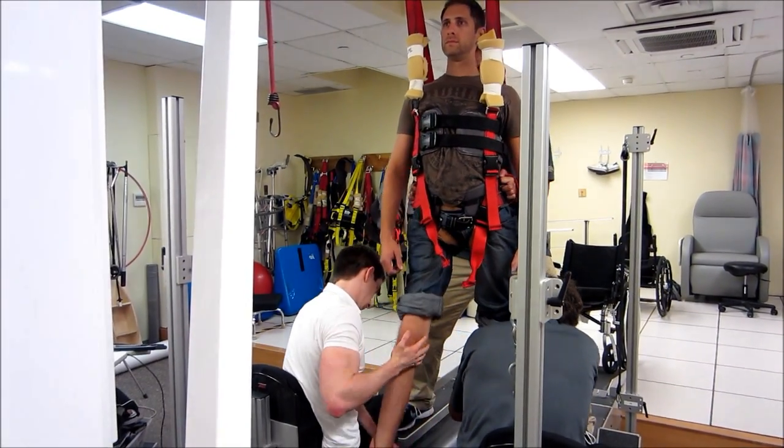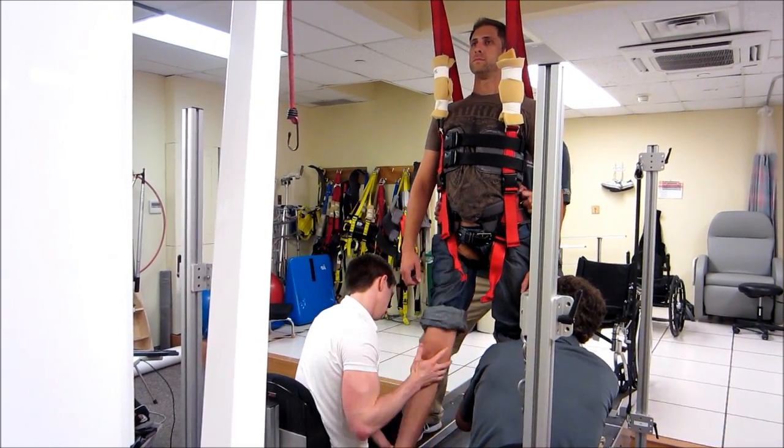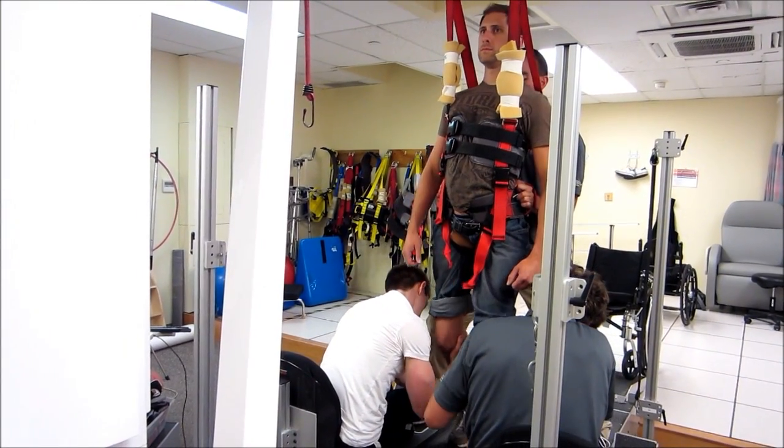A good tall posture while I decrease the weight support. So I'm going to start dropping the weight — it'll come off. I'm going to start dropping the weight.